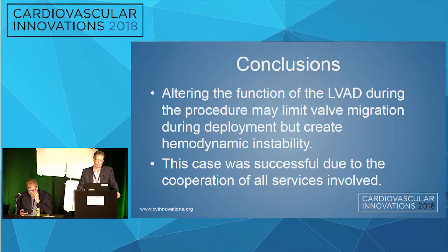For the final deployment, we had the person up front, position 1, pulling hard. Yeah. And actually was able to maintain it in place as everybody else was beginning to deploy it. Yeah, good. All right, that's great. Thanks.